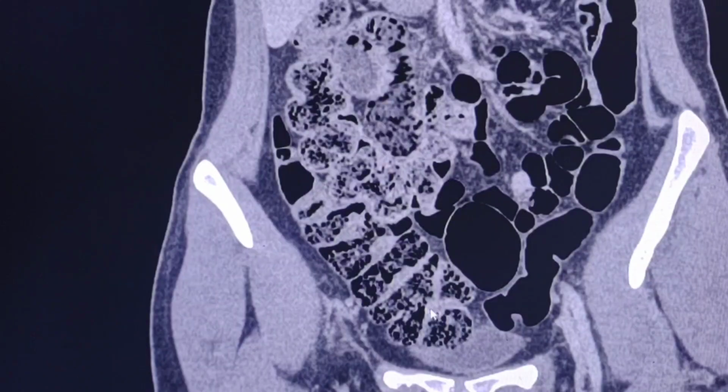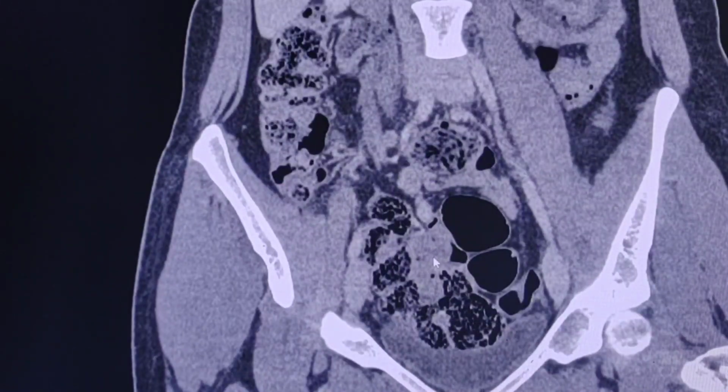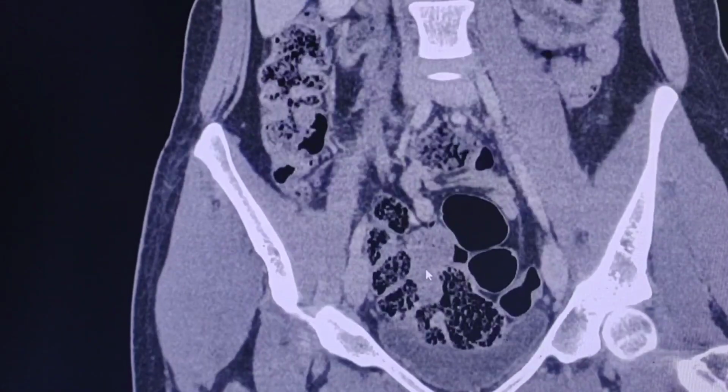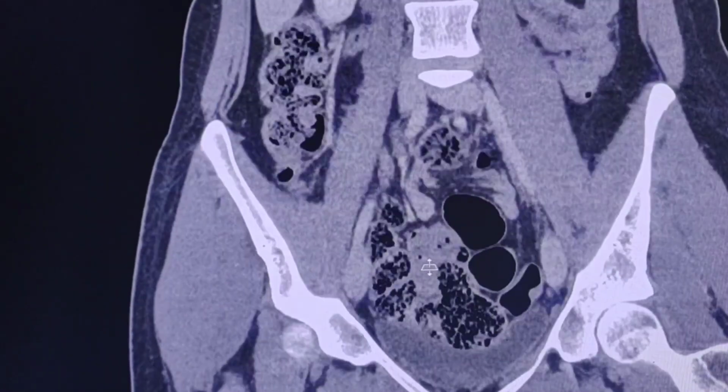This is the right colon, the cecum, and here is the ileocecal valve. There is no evidence of any tumor or any obstruction here, but anyway we can see fecalization of the terminal ileum as well.